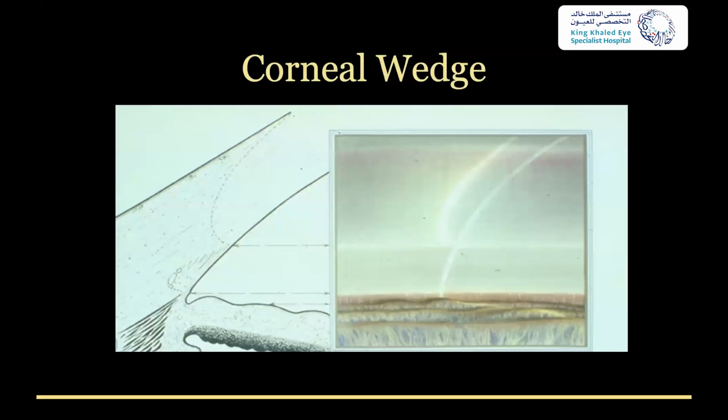So this is a Lee Allen painting. He always makes the Schwalbe line look like something. I can almost never actually see Schwalbe line. But with the corneal wedge, you can tell where it is. This is a young boy. I would never be able to tell you where his trabecular meshwork started if I didn't use the corneal wedge. But you can see the skinny internal beam, and the crisp, fat, fuzzy external beam. They illuminate the face of the sclera and they join there at Schwalbe line. Right there.